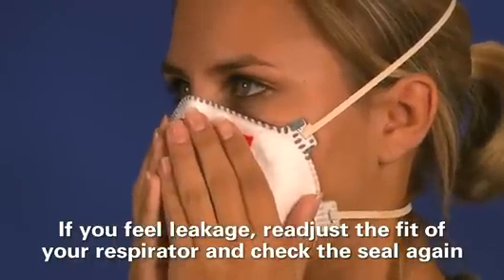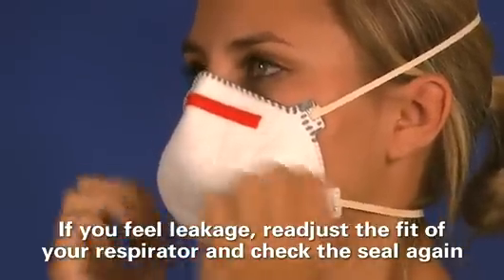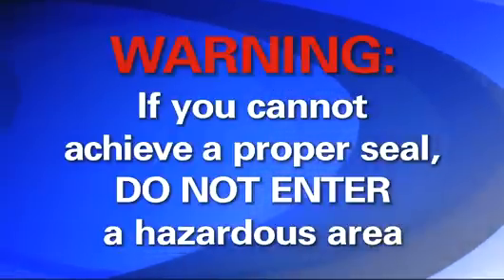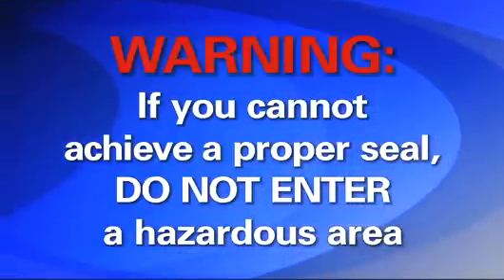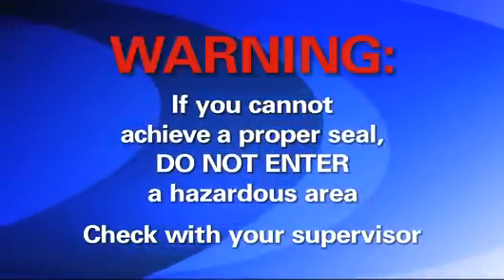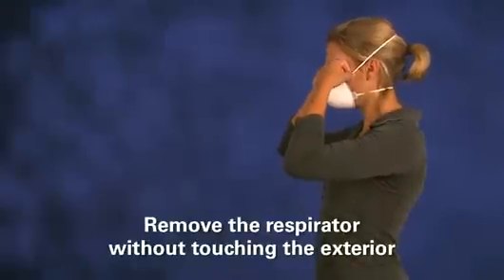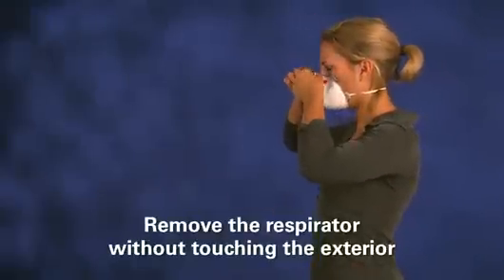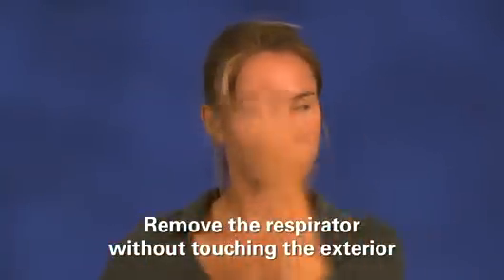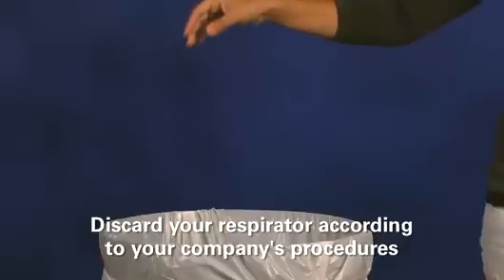If you feel leakage, readjust the fit of your respirator and check the seal again. If you cannot achieve a proper seal, you are not protected and should not enter a hazardous area. See your supervisor to determine what the problem may be. When you're finished wearing the respirator, carefully remove it without touching the exterior because the exterior may be contaminated. Discard your respirator according to your company's procedures.